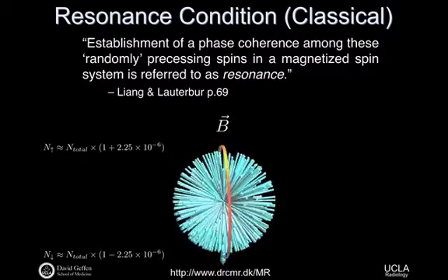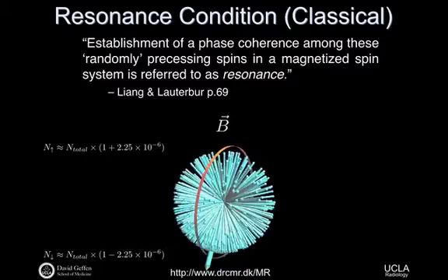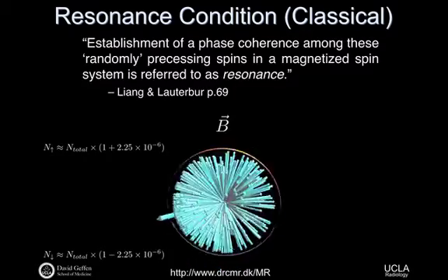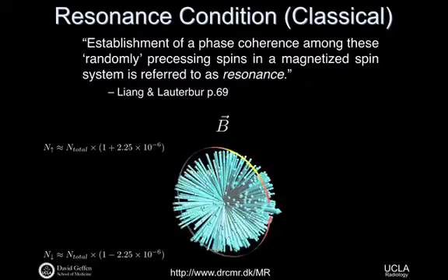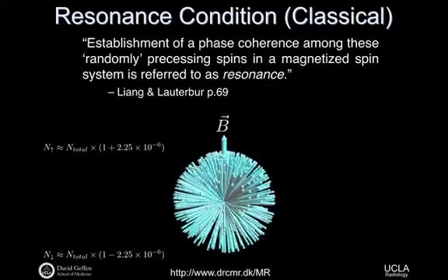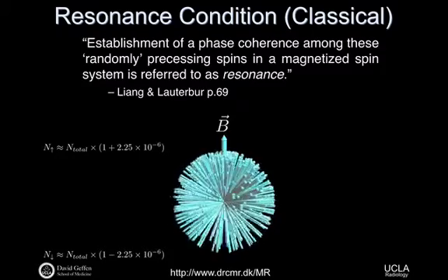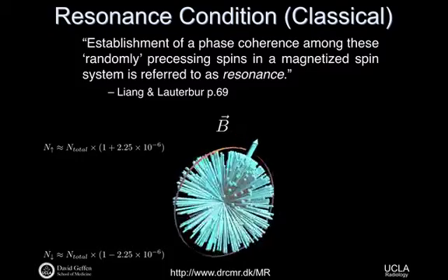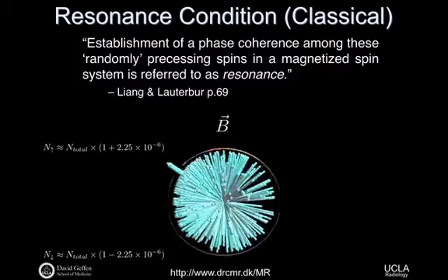And so, again, you're observing the action of two B fields here, right? Which field is causing the precession? And which field's causing the nutation? B1. Those two systems acting together impart different components of the overall rotation.